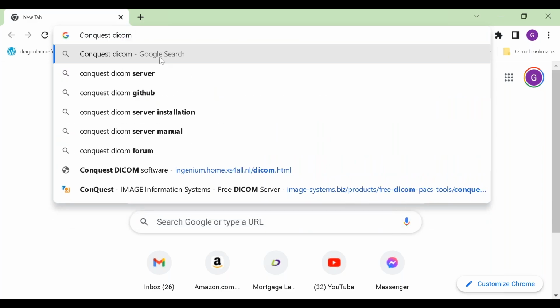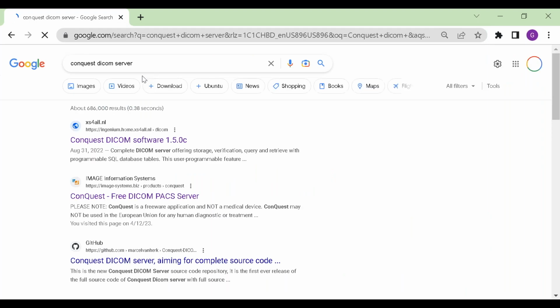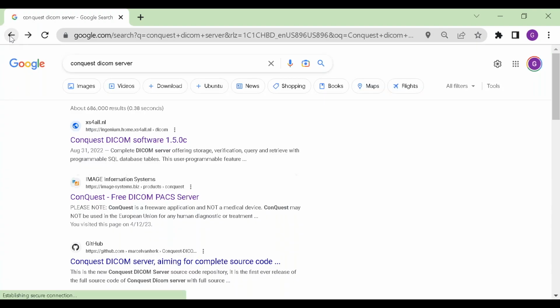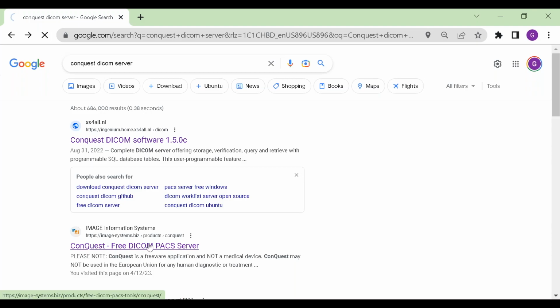We're going to type ConQuest DICOM. I didn't even get the whole thing out there. And notice here it gives me a link. I'm going to click on that link. This is actually the correct website. The one that I referenced on the bottom is actually the next one.